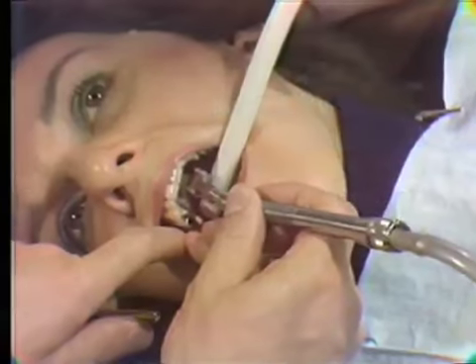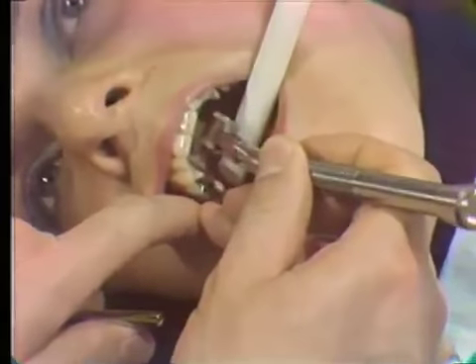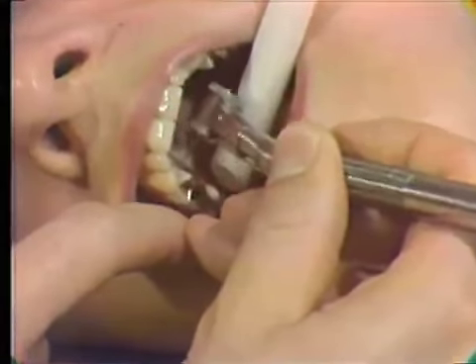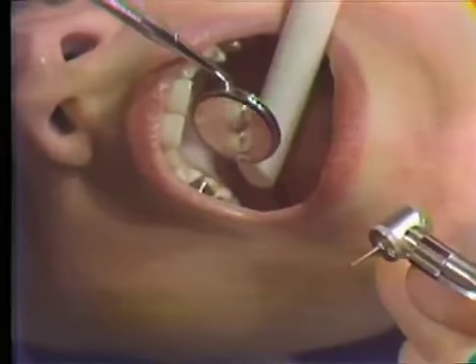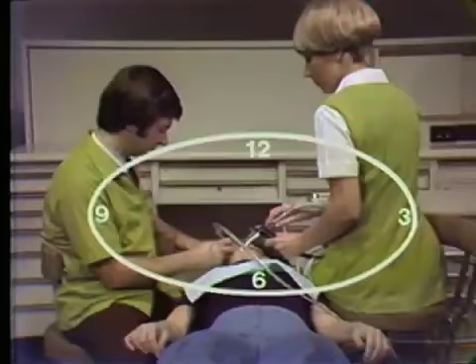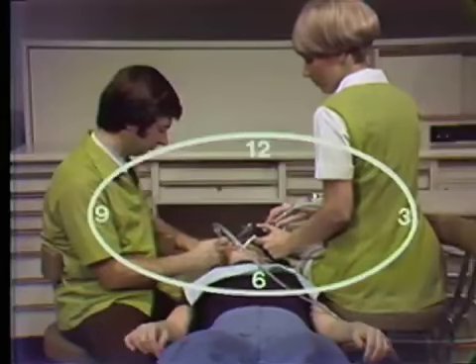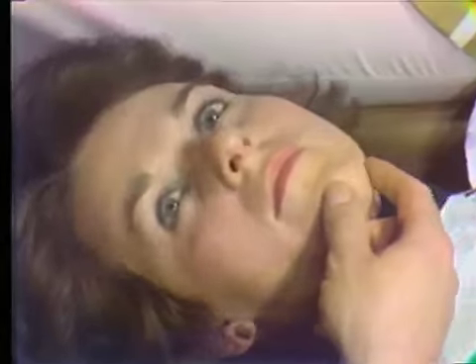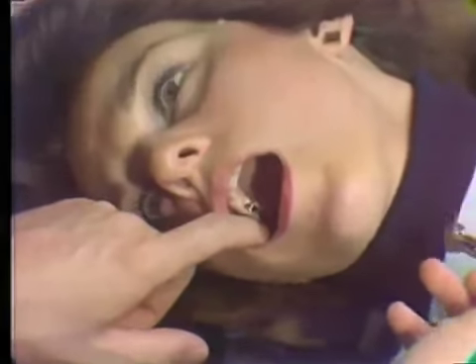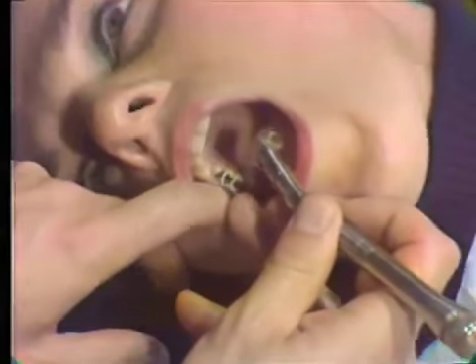Direct vision is recommended while using a lingual approach to the maxillary right posterior segment. However, close inspection of the cavity preparation can be accomplished using indirect vision. The operator can work from the 9 o'clock position with the patient supine. The patient's head must be turned considerably toward the operator, and in most cases the chin is elevated to the maximum. The operator's left index finger is used for the retraction of the cheek. The retraction finger is also used as a finger rest for the right hand.